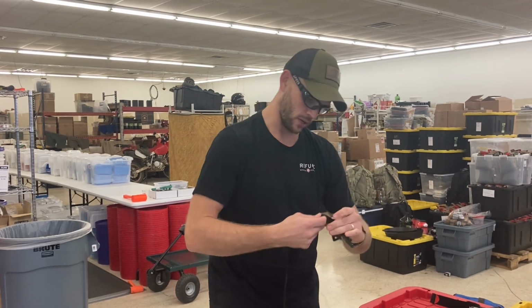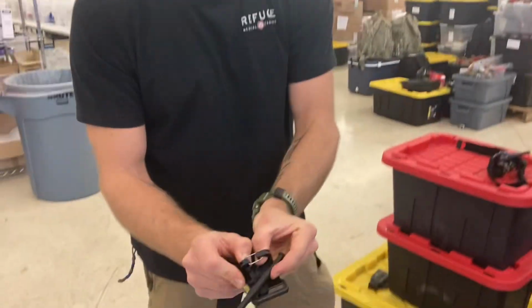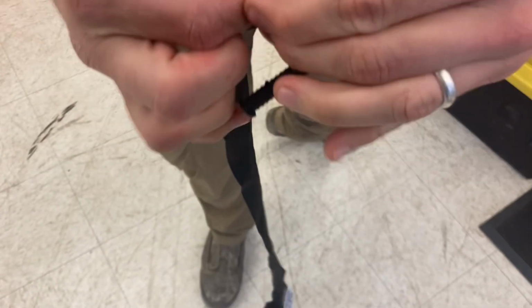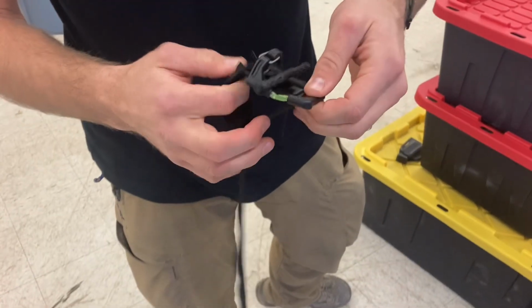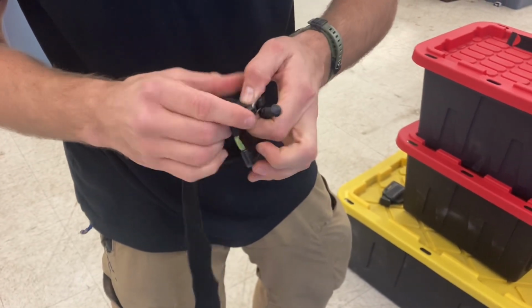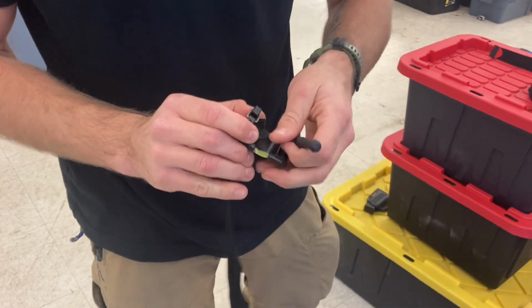This is loose. You can even see it's binding up here. That's weird. You see it's doing that, it's doing this fold. And I don't know why, and I shouldn't have to wonder why. If you buy a product, I shouldn't have to wonder why it doesn't work, especially when it's a life-saving item like a tourniquet.